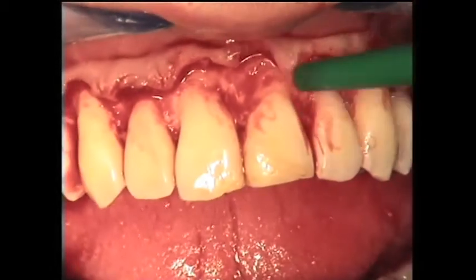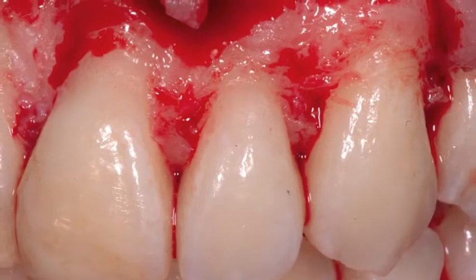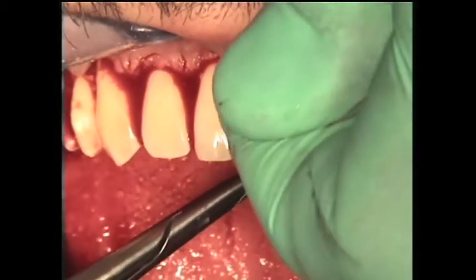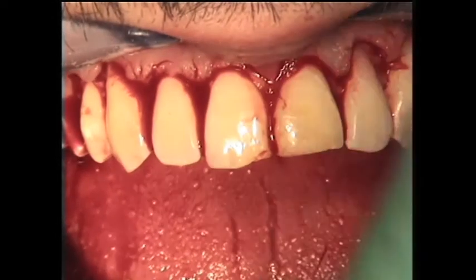As you can notice, now we have a brand new biologic width, and the soft tissue can actually adjust with single interrupted sutures, possibly placing the knots in the palatal aspect for aesthetics with a resorbable stitch.